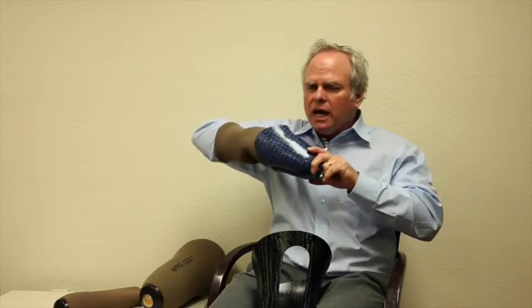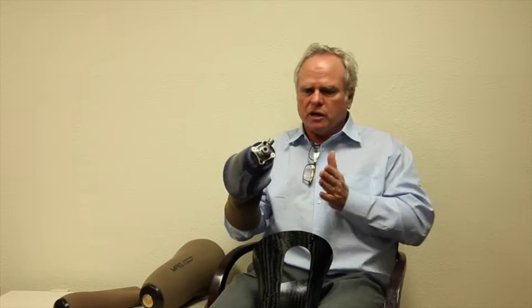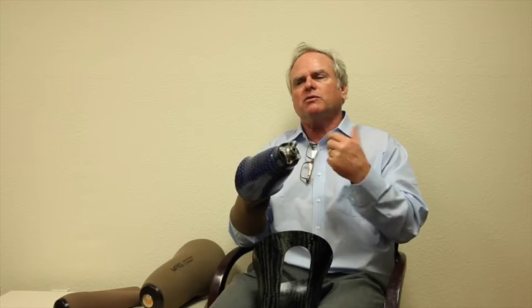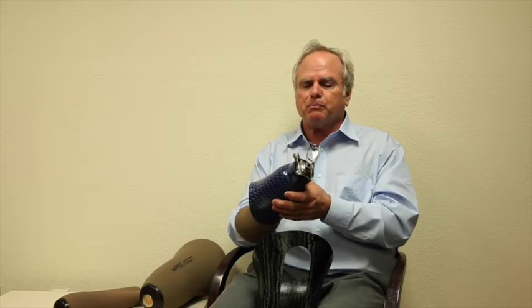Now we're good. So a lot of those patients that are having issues with finding the pin, they wait for the second click because they're going in at an angle. Be aware of that when you're fitting your patient. Don't think as soon as you hear a click you necessarily have it perfect. Be cautious at first until you understand the system.